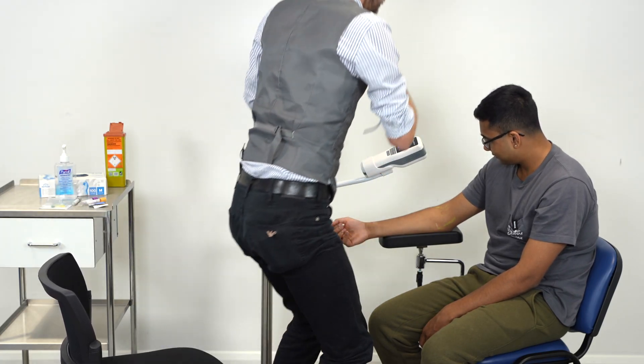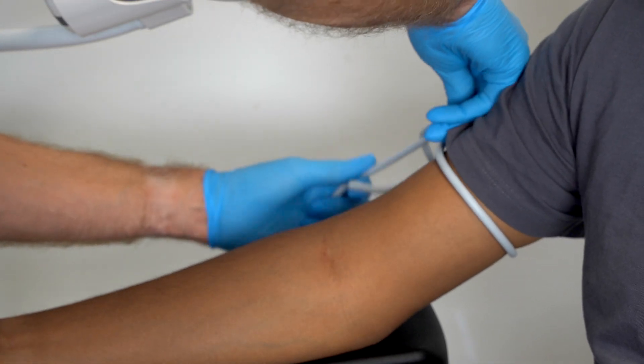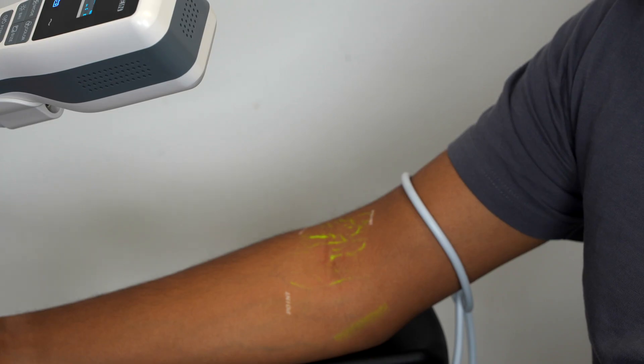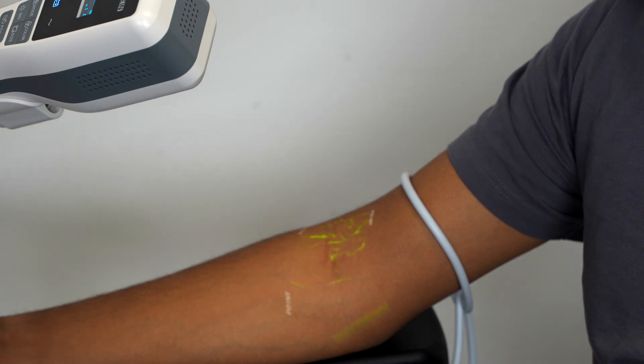So I've just got the tourniquet to start off with. There we go, that's in place. The crucial thing about finding the vein is it's not just what we can see, but what we can feel as well. There's a good vein appearing here — can you see that?